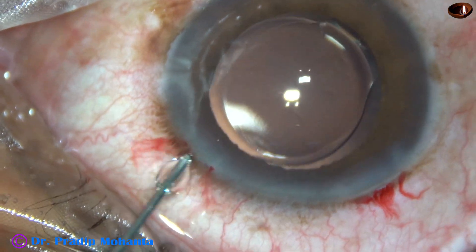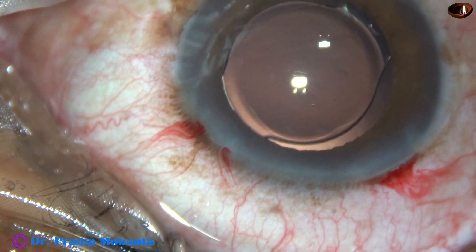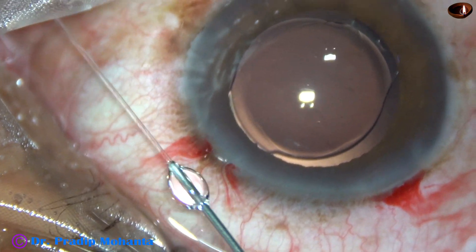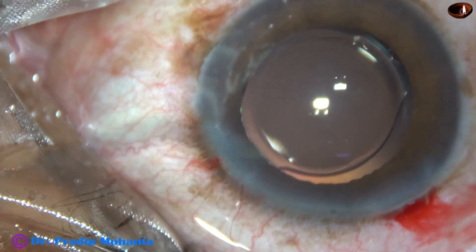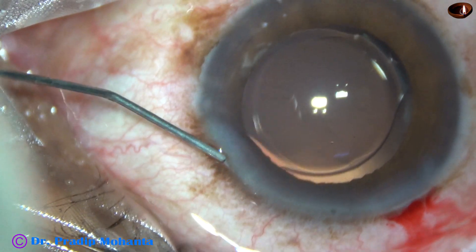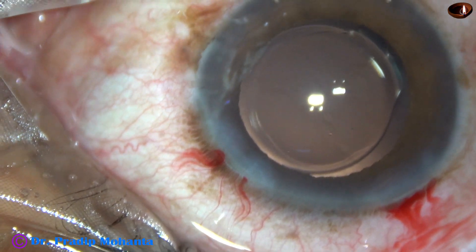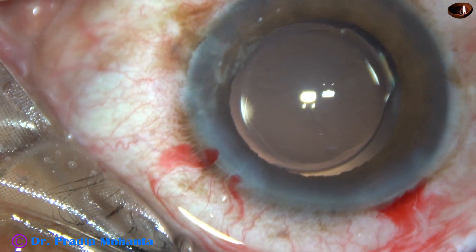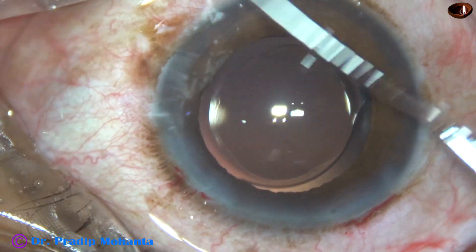Now a bit of moxifloxacin is instilled. The only side port made in this case is closed by hydrating the corneal stroma on either side of this paracentesis wound. Then a final lavage of the anterior chamber is carried out.